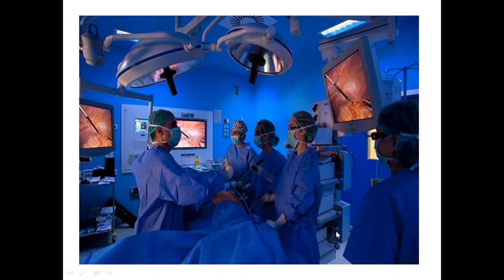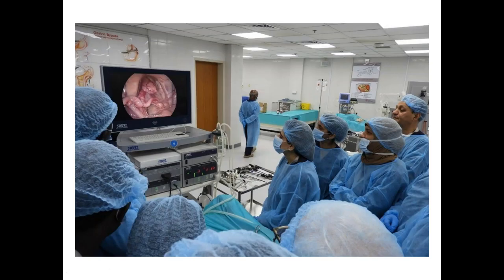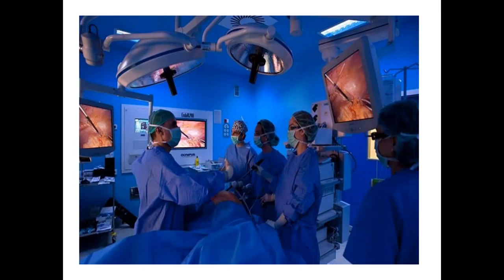customized for laser there. You do not need working top lights at that time. You switch them off, otherwise they're going to create glare, and therefore you wouldn't be able to see things properly. So minimal invasive surgery is done in a dark environment as compared to maximal invasive surgery, where you do it in the illuminated area. The illumination in minimal invasive surgery is inside, right? You can see in the monitor how illuminated it is.